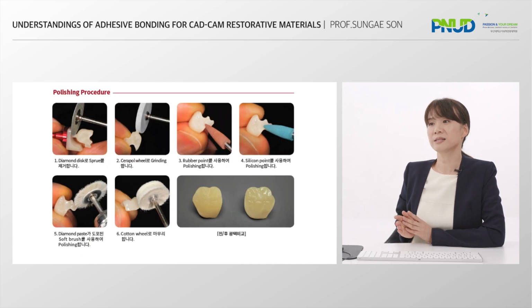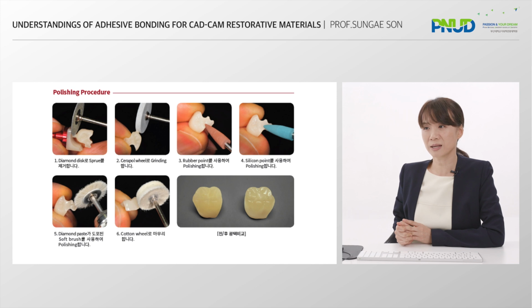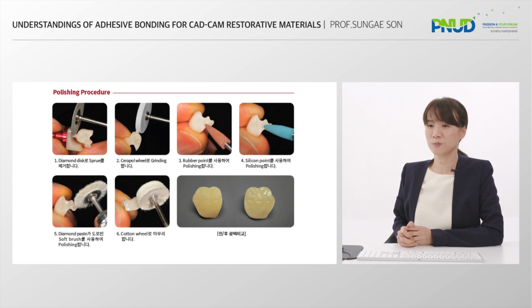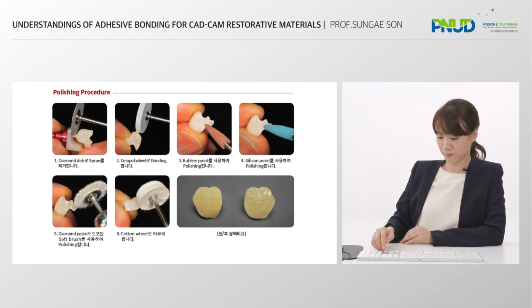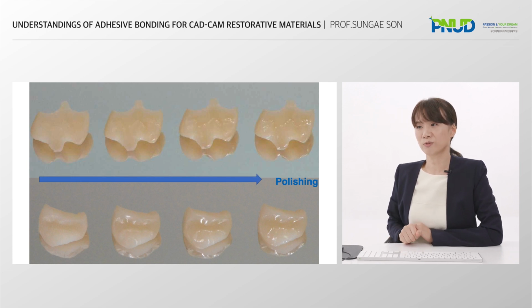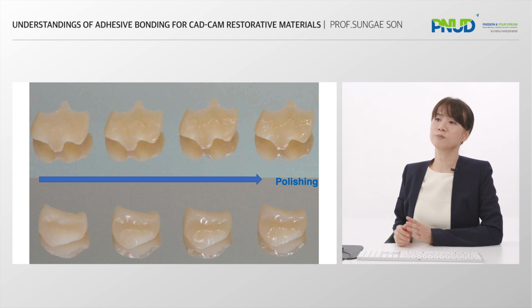After the milling process, many hybrid ceramics don't need any post-treatment. It has the advantage of being finished by grinding immediately without any post-treatment. The gloss and surface property of the restoration can be improved depending on the degree of polishing.